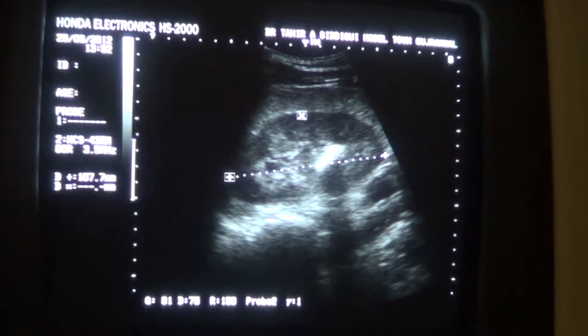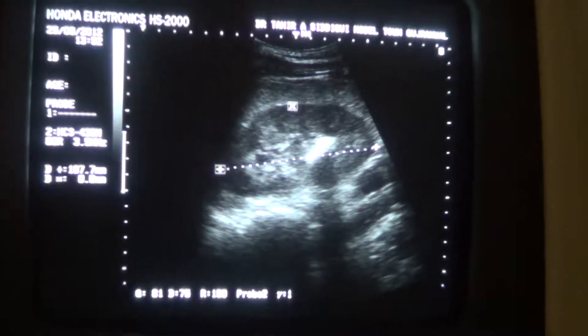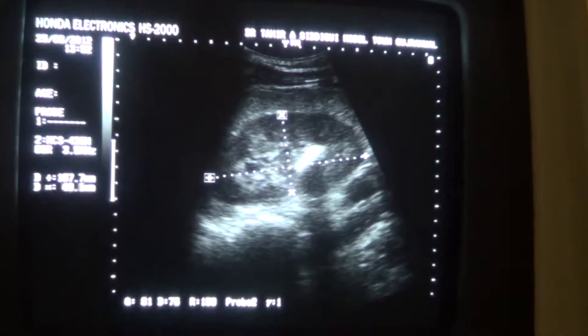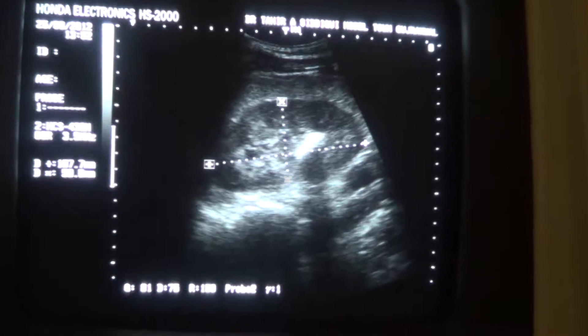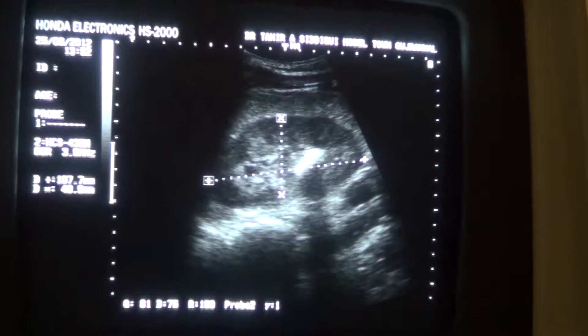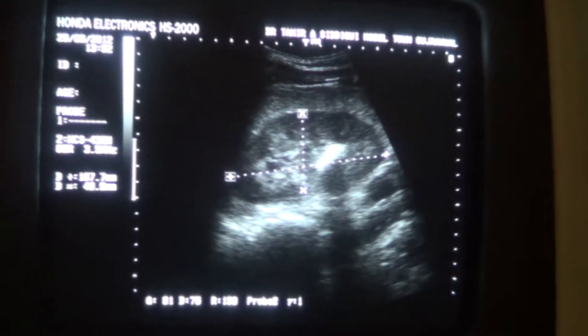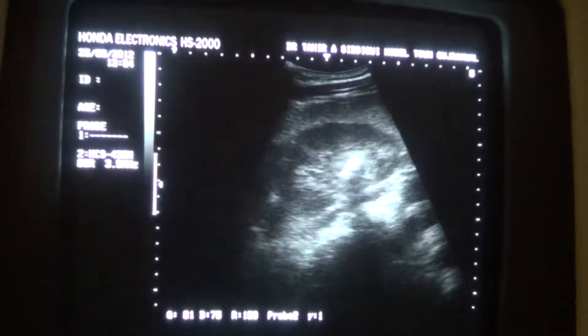The kidney is normal in size, measuring 10.7 cm in length and 4.9 cm in anterior-posterior diameter.